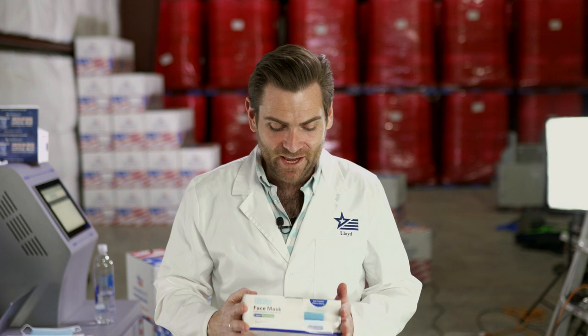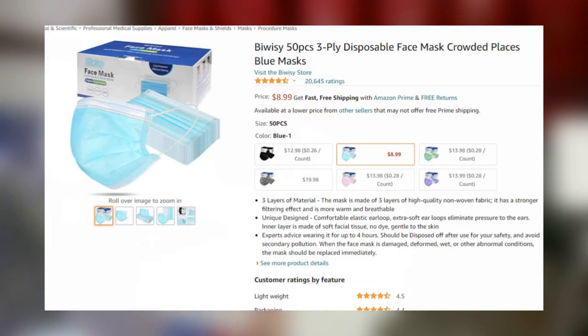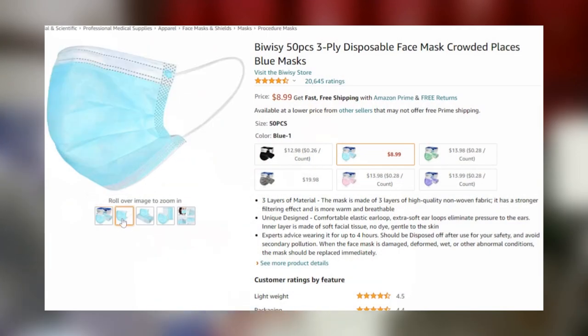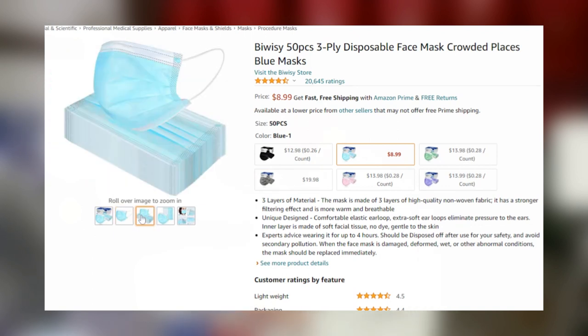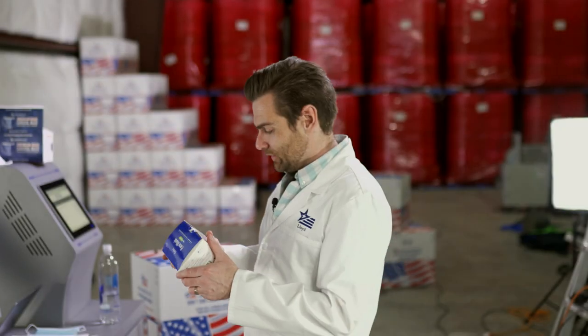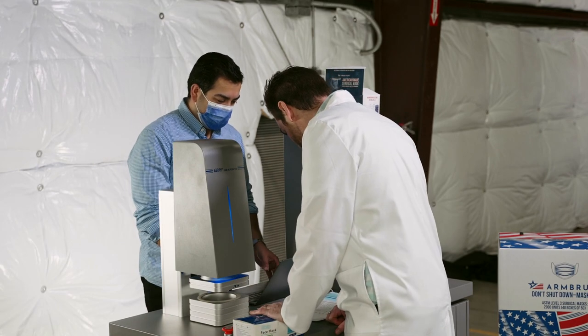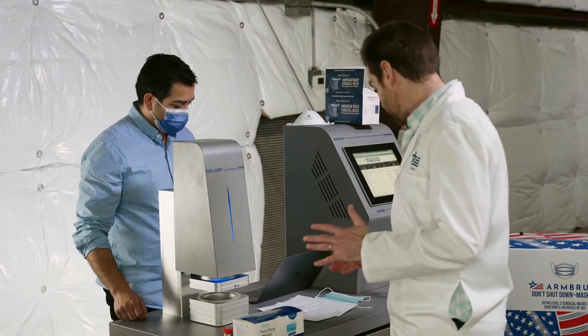Alright, thanks for joining today. We are testing every single mask on Amazon, which sounded a lot easier when we first started. Today we're testing the Biwisy face mask — I'm sure you've heard of Biwisy before. I mean, we're all wearing Biwisy all the time. I love these brand names. This one looks like it was made by a random letter generator. We bought a 50-pack of this for $8.99 — extremely affordable.